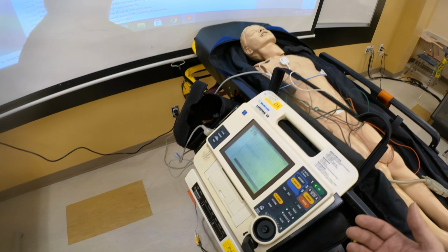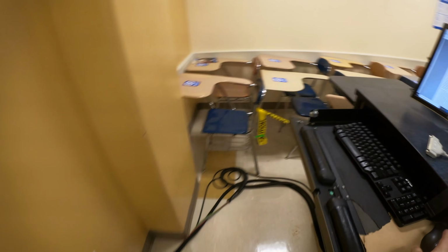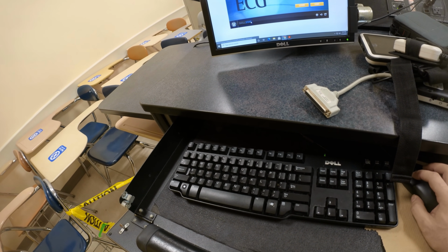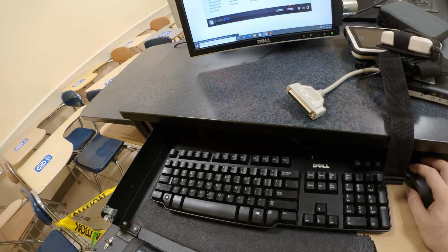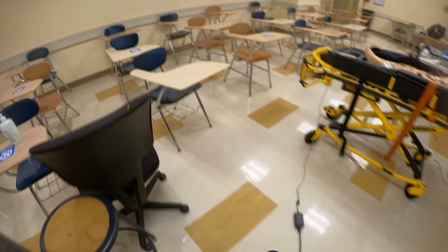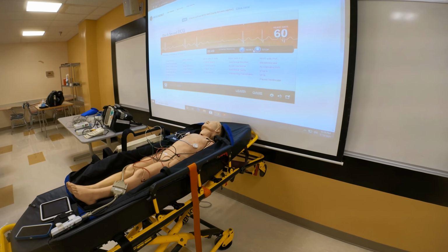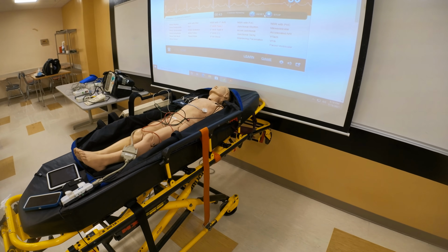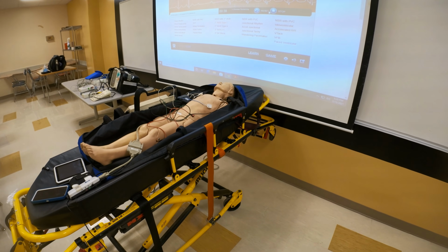And the reason why this is important, if you run this skill station, and I've seen some instructors do this, let me put this up, they'll put a rhythm generator, something like this, on the screen and they will say, all right, play. And whatever rhythm comes in, they'll have the student from the seat see this rhythm and they will say, what is the rhythm? The students give the interpretation, and then they will say, okay, what therapy are you going to provide? They'll say, I'll do this, this, or this. Same thing, they'll put VTAC, and they'll say, I will synchronize cardiovert, or I'll defibrillate.